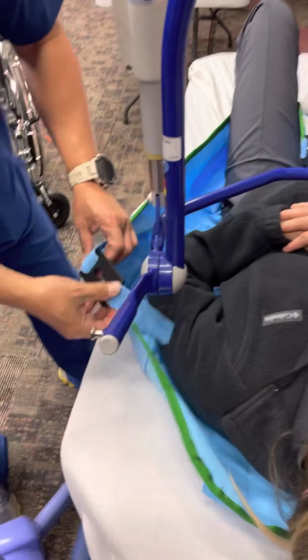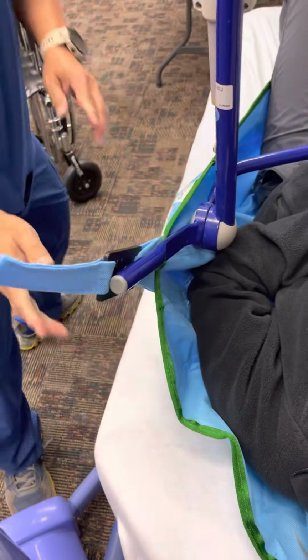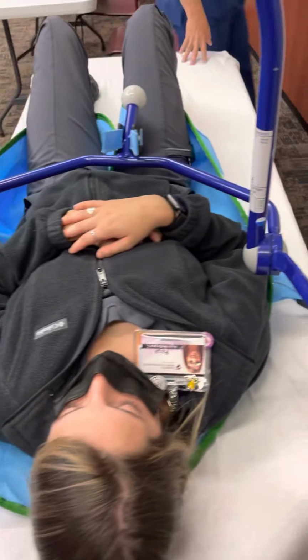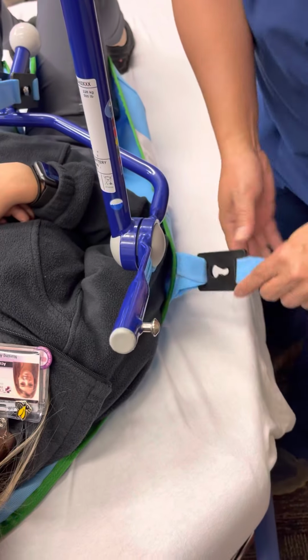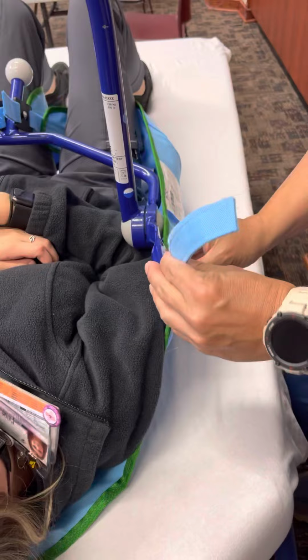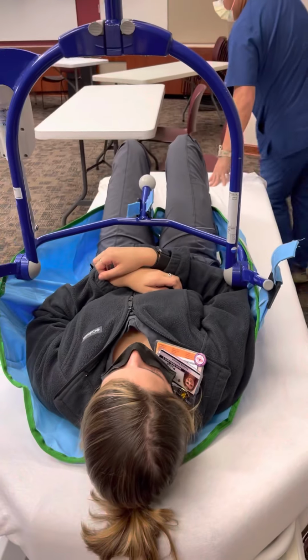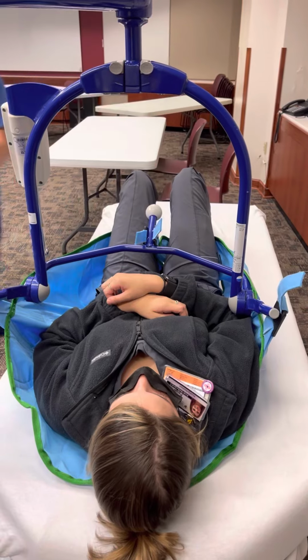And the next strap is over here. Unfortunately, I have to kind of pull up a little bit over there. The other one right here. And you should feel it click or snap together right there, so it'll be secure. Now the base is ready to be raised up. And here's the control right here.